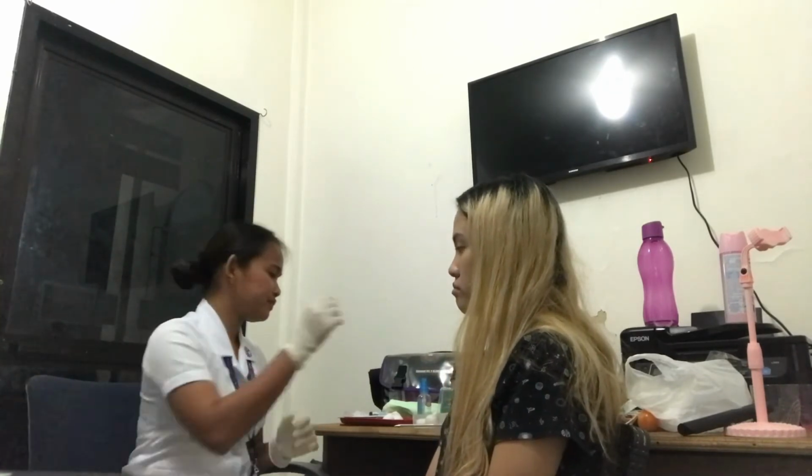So now we're going to place the patient in a comfortable position and ask the patient to relax the area we're going to inject. So ma'am, please just relax your arm, okay? So now we're going to apply clean gloves. So we need to clean the site with an antiseptic swab in a circular motion starting from the center outward.